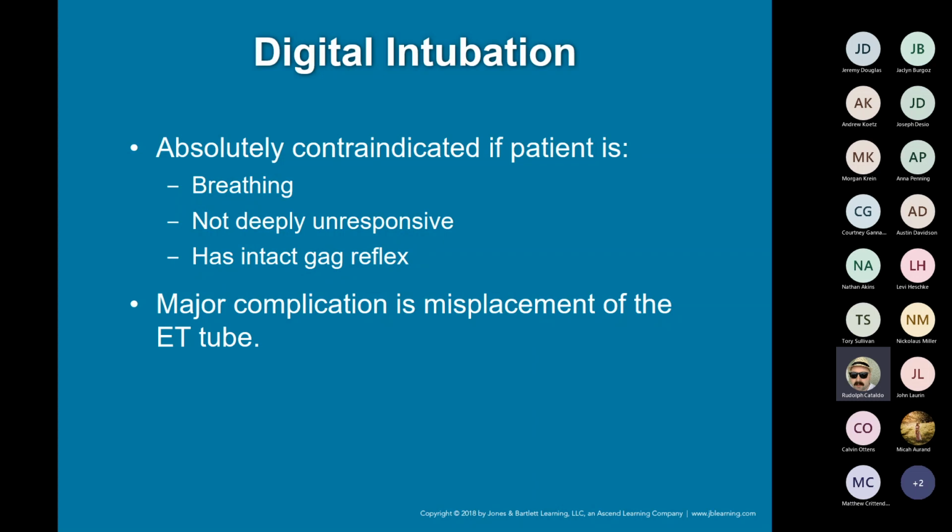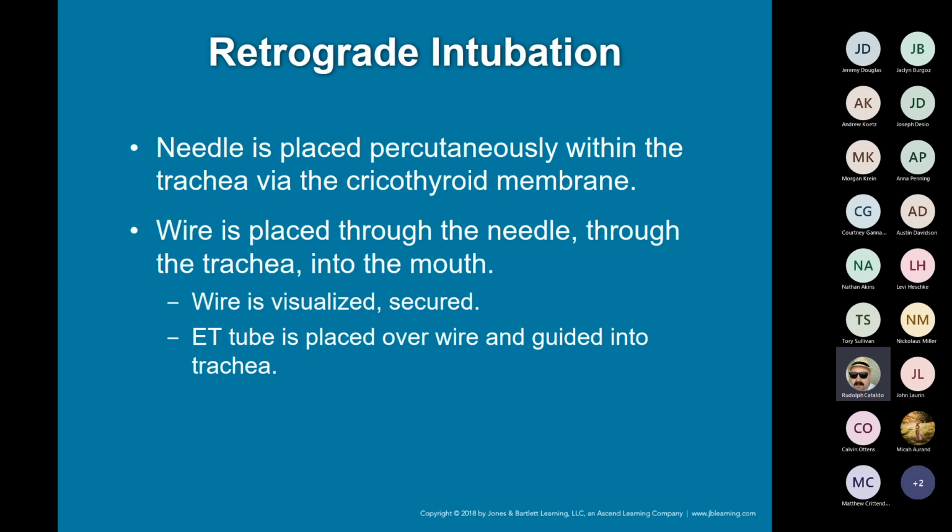Now, it is very easy to misplace the tube in this because, again, you're doing this blindly, off of feel. Well, I can tell you, I've never truly put my fingers in somebody's mouth and felt what their trachea feels like. So, of course, there's going to be a potential for error. When you think digital, you always want to think screen, but think literally your digits, your fingers.